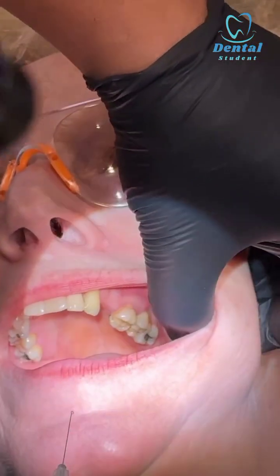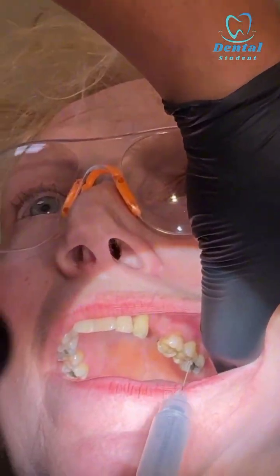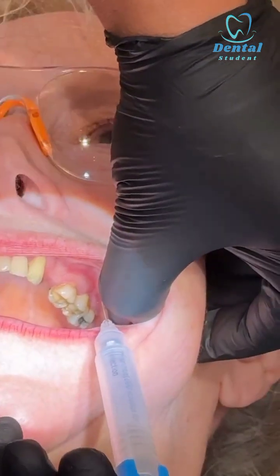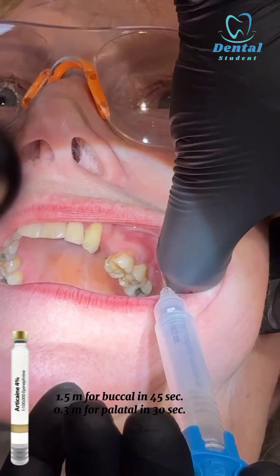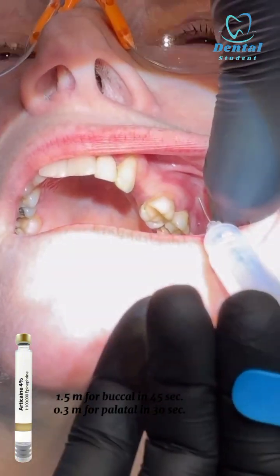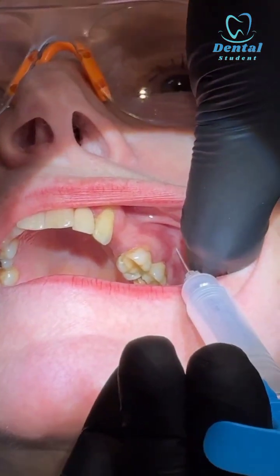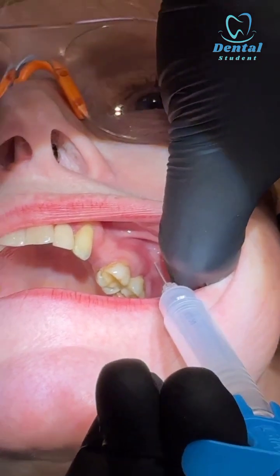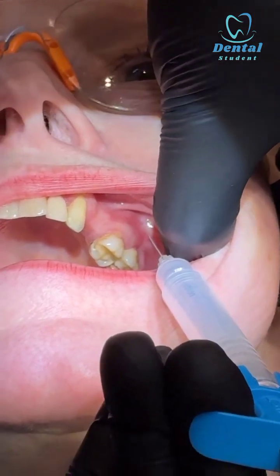Anesthesia for extraction of the upper left seven. I go at 45 degrees to the tooth toward the direction of the root — sharp scratch. I'm using Articaine with adrenaline, injecting very slowly toward the apex of the tooth.